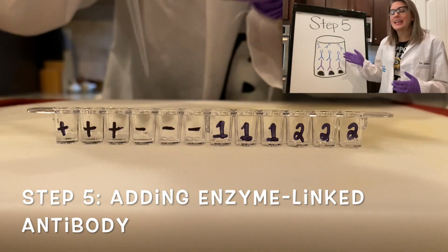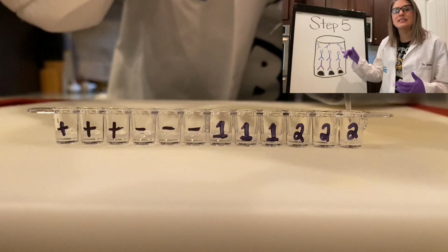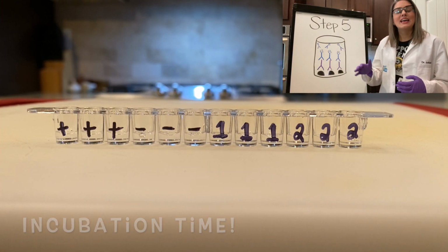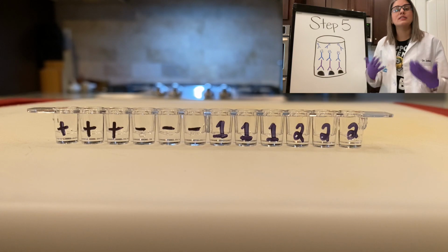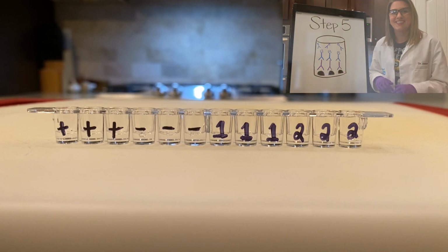Now we're adding in that enzyme-linked antibody. That's that lab-generated antibody that has an enzyme on top. That enzyme, the little Pac-Man shape, is gonna help speed up a chemical reaction that's gonna let us know whether or not these antibodies are present by causing a color change. But not quite yet, we've got 2 more steps to go.